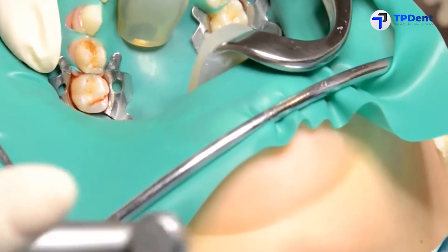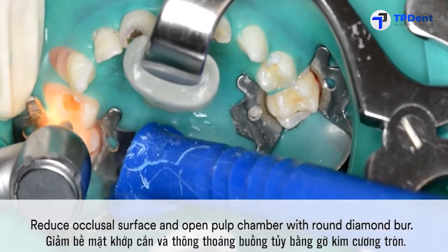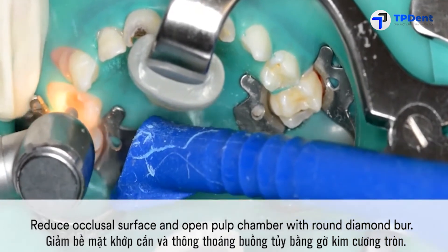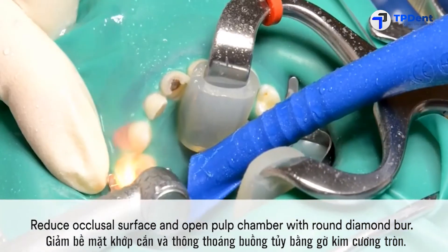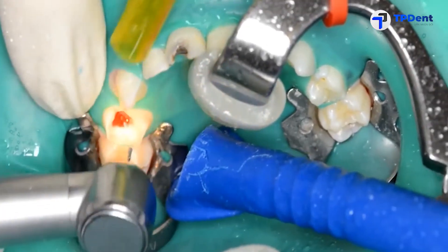Then place a rubber dam to ensure a clean, dry environment and good visibility. In this case, the dentist determined that pulp therapy was necessary. When faced with that situation, reduce the occlusal surface and open the pulp chamber with a round diamond burr.